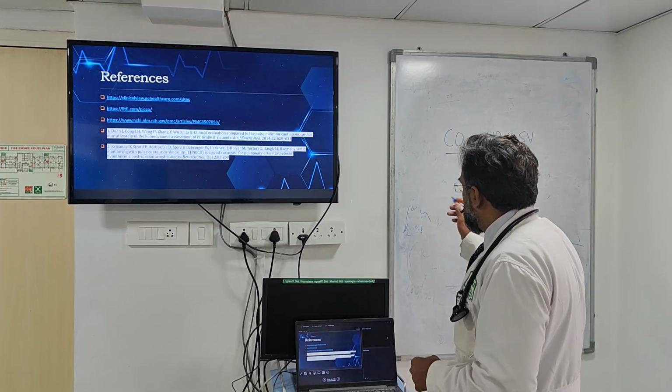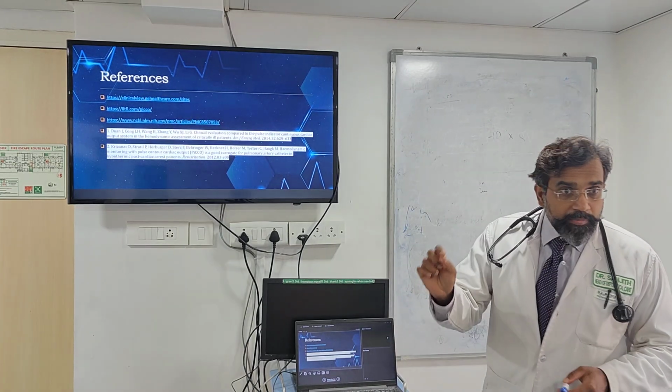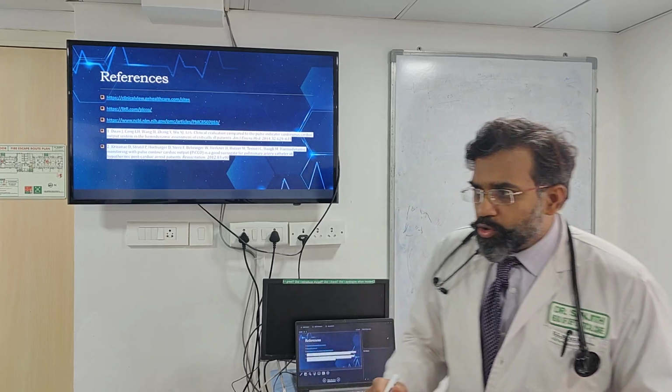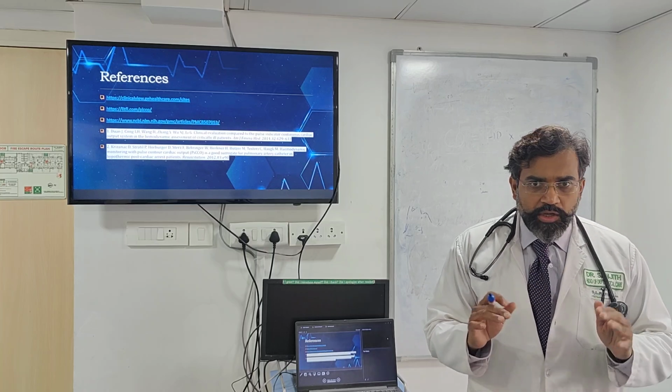Picco. All right. Now, what you must understand is Picco is using two technologies. I'm just going to repeat this. Some things would be repetitions, but I'll explain a little bit more in detail. So, when I say Pulsion Picco, it is using two algorithms to give you output.